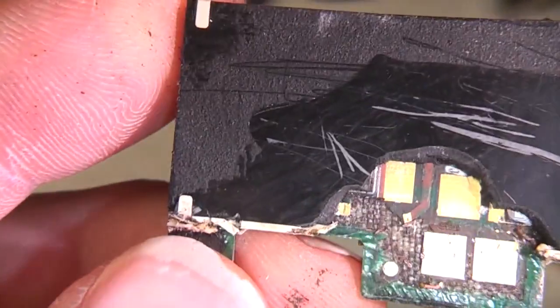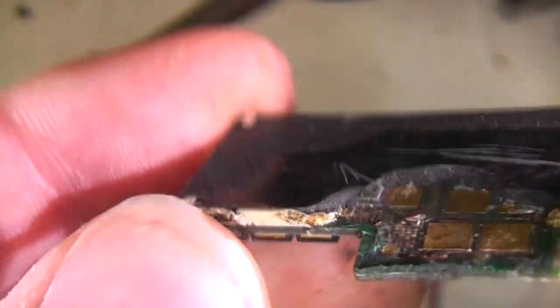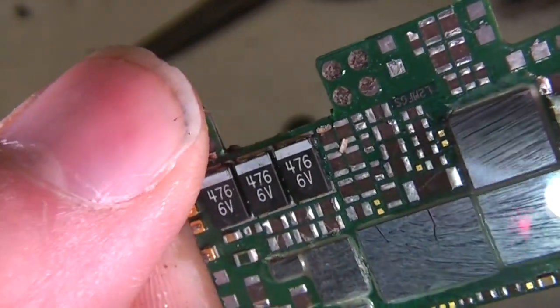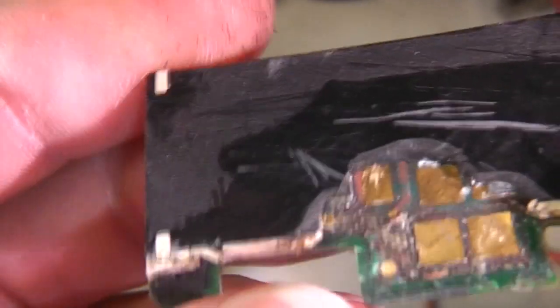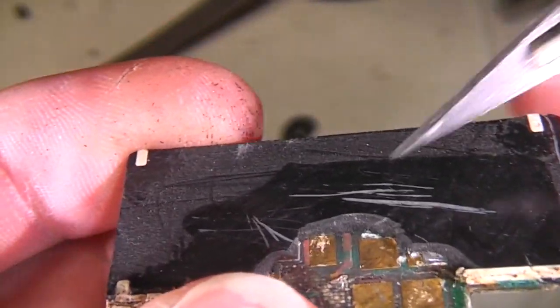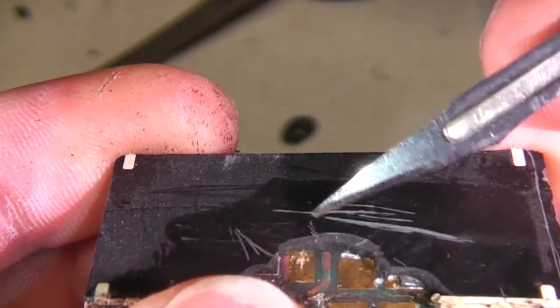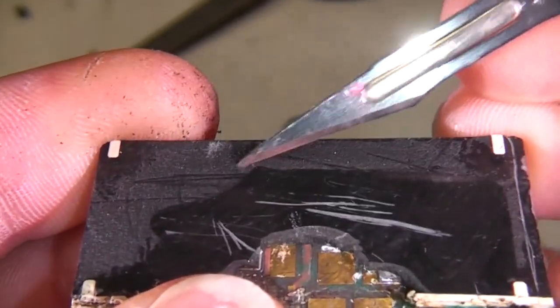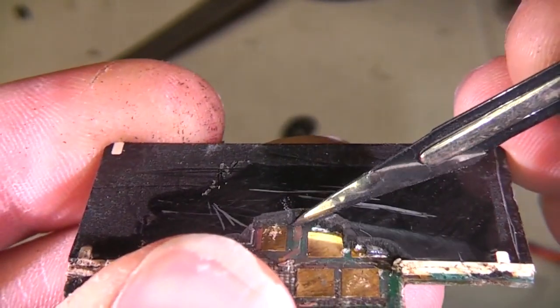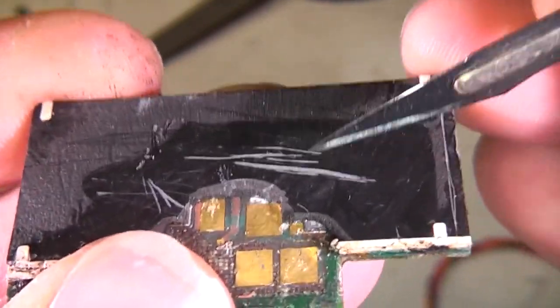Right, this potting compound seems to be extremely tough. One of my usual techniques for attacking this stuff is to put it in some dichloromethane based paint stripper for a couple of days, and most epoxies it tends to soften and swell it. This has been in there for a couple of days, although the weather's been quite cold, but it just seems to have no effect at all. So maybe it's something else other than epoxy, or it does seem to be very heavily glass filled. There's a slightly sparkly look to it, so this is a very, very tough potting compound.